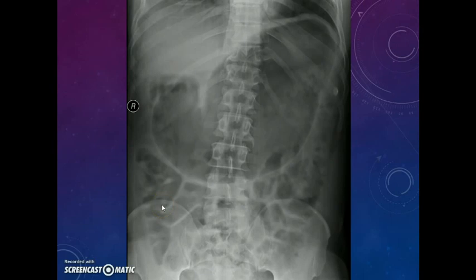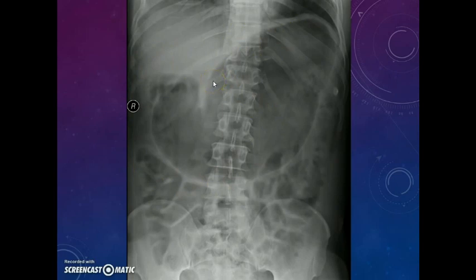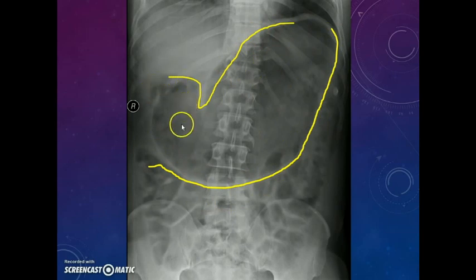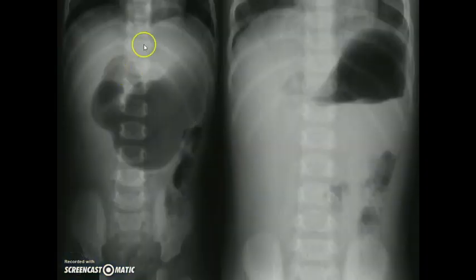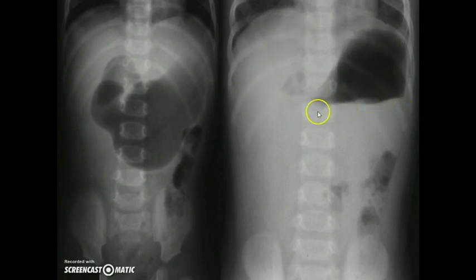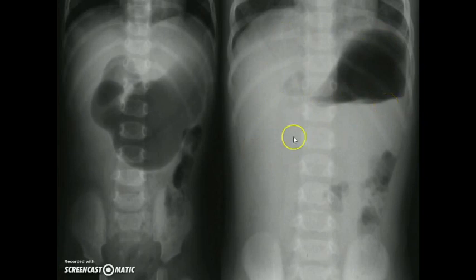First, see this X-ray. Which bowel would be this large, showing this shape? You can see the greater curvature and the lesser curvature, the antrum of the stomach. This is the stomach we see in an abdominal X-ray supine view — showing the dilated stomach. In the erect view, we see the large air fluid level of the stomach. In this case, the obstruction must be at the level of the pylorus — we are seeing a single large air fluid level suggestive of gastric outlet obstruction.